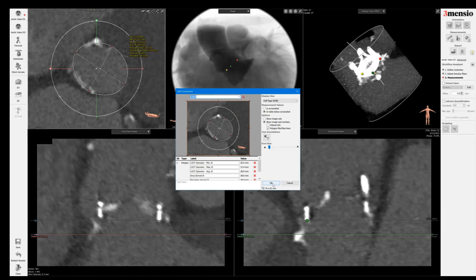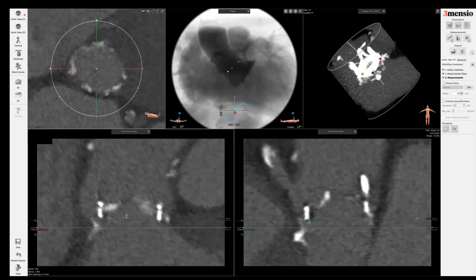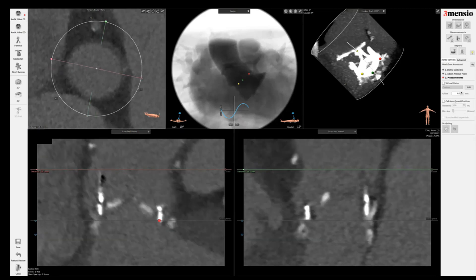So I take the LVOT here. If you think I'm moving too fast, you can certainly go back to my previous video to learn more in detail about how to do some of these measurements. But just in the interest of time, I'm going to do this in a relatively quick manner.